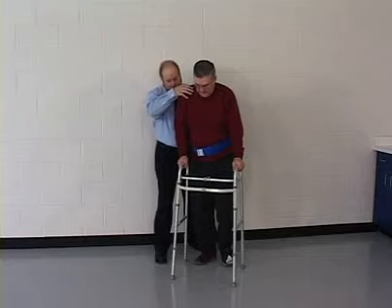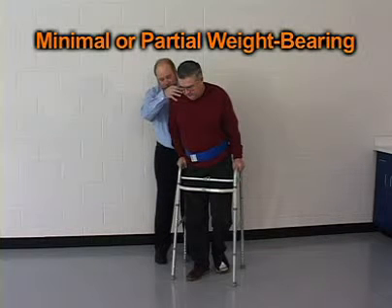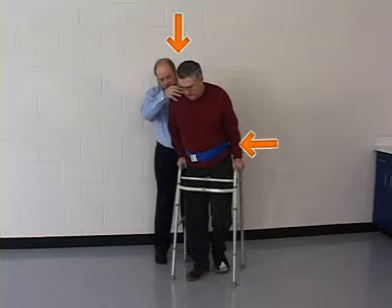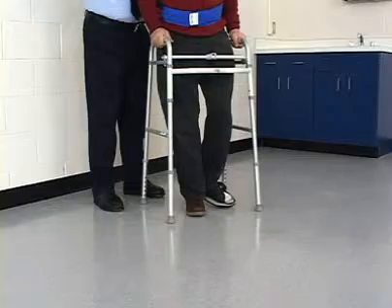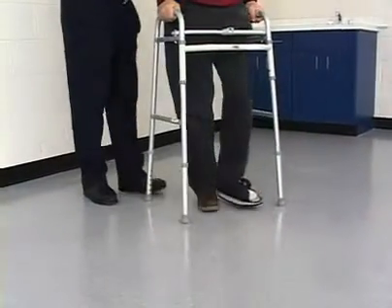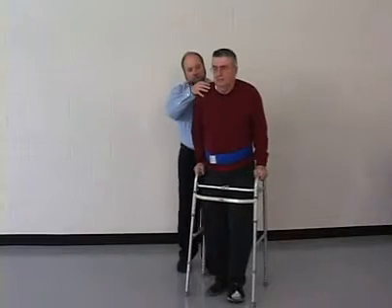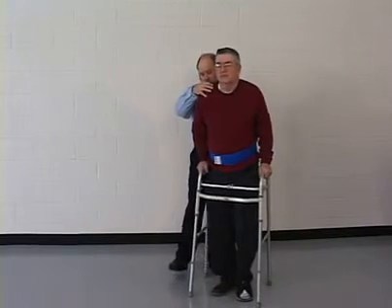For patients who use the three-point gait pattern, the therapist must be positioned in stride, behind and to one side of the patient. The therapist then grasps the gait belt and the patient's shoulder. Again, the patient begins by standing centered in the walker. The involved lower extremity is not rested on the floor. It may be held with the knee in extension, putting the foot in front of the patient, or it may be held with knee flexion, putting the foot behind the patient.